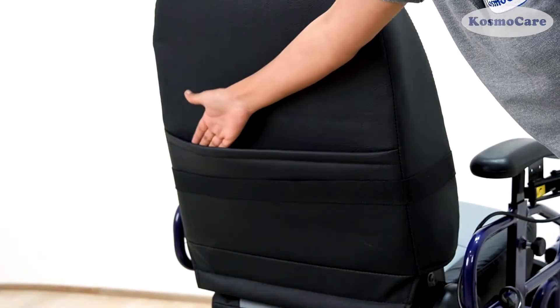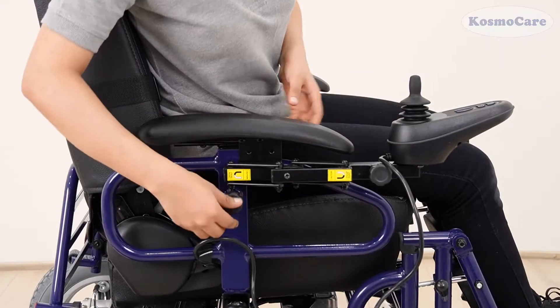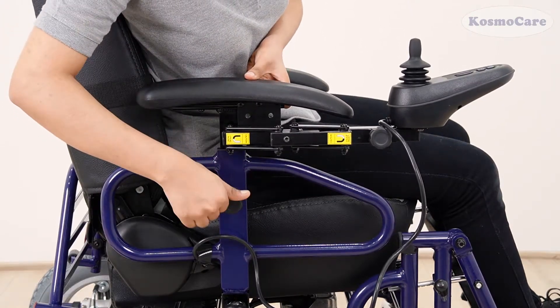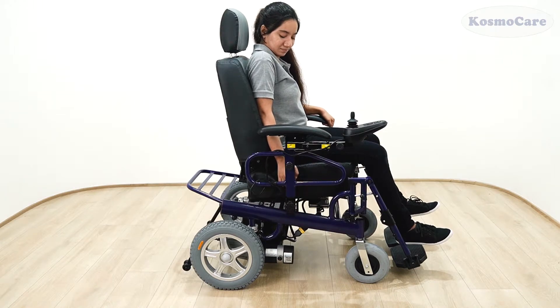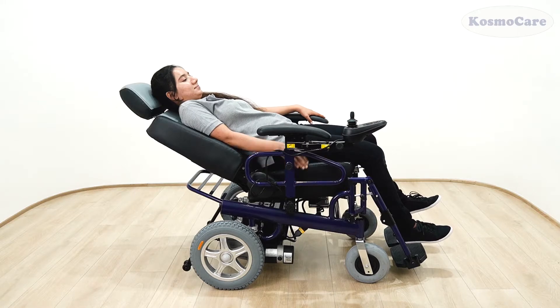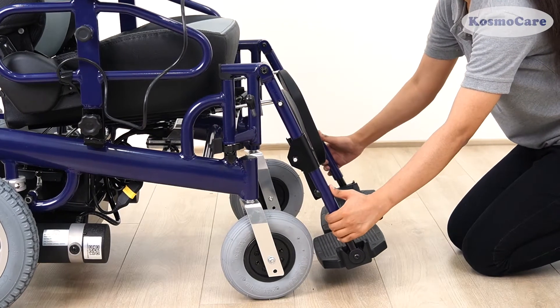Store your essentials in the back storage pocket provided while keeping your hands free. Adjust the height of the armrest to the desired level. The back recline and footrest elevation can be easily adjusted at multiple levels as desired.